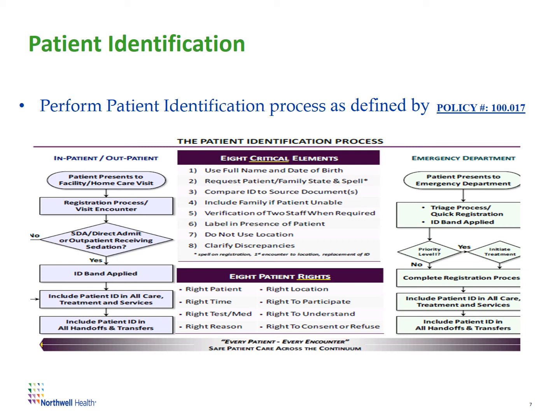You can go through this list for inpatient versus outpatient patients and the emergency department. It is slightly different between the inpatient and emergency department patient identification. However, most of the key elements are there, which are the 8 rights given in the middle.